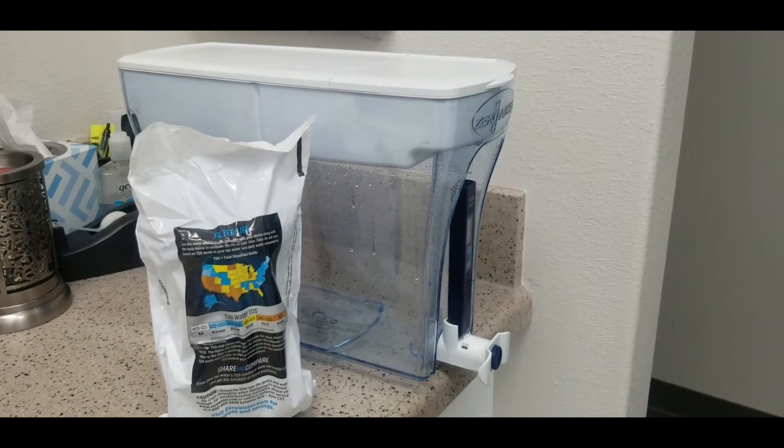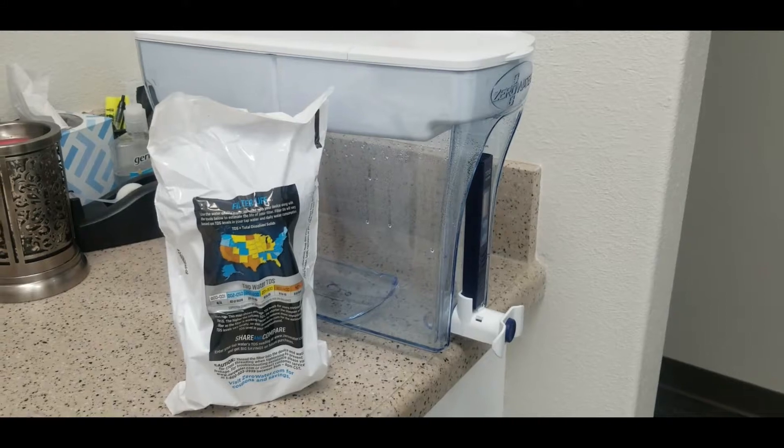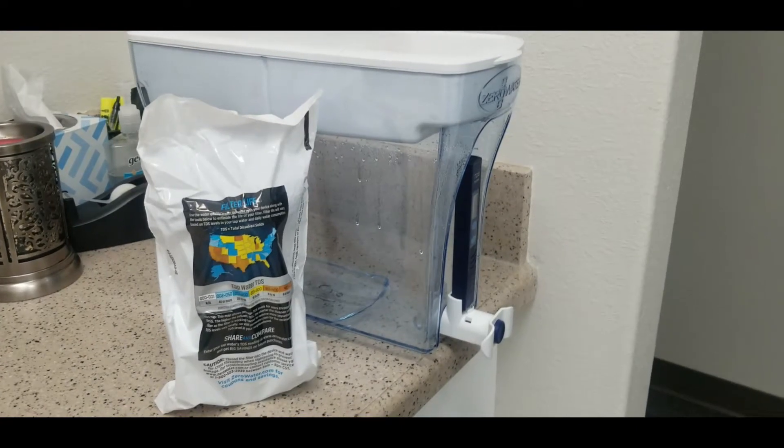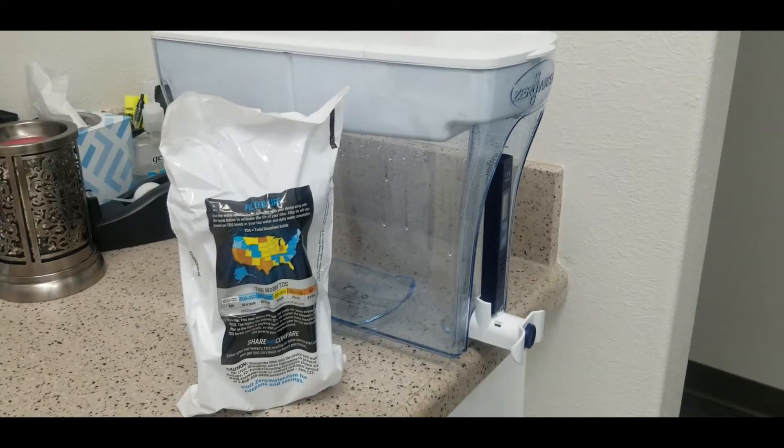I want to show you how you can use a zero water filter as an alternative to distilled water in an autoclave. You can use this for any autoclave, you just have to make sure that you filter the water properly.